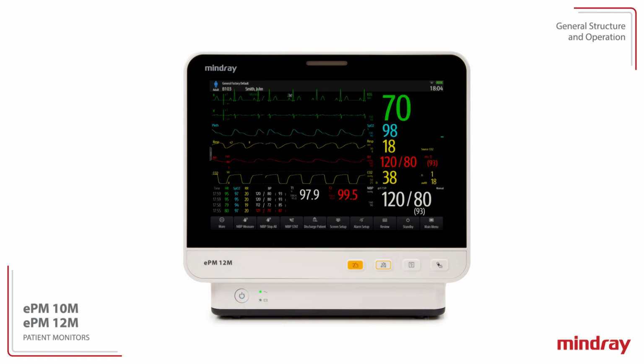To the right of the power switch, there are two indicators. The power indicator illuminates green when power is connected. The battery indicator shows the status of the battery. The battery indicator illuminates green when the battery is fully charged, illuminates yellow when the battery is charging, and flashes green when the monitor is operating on battery.